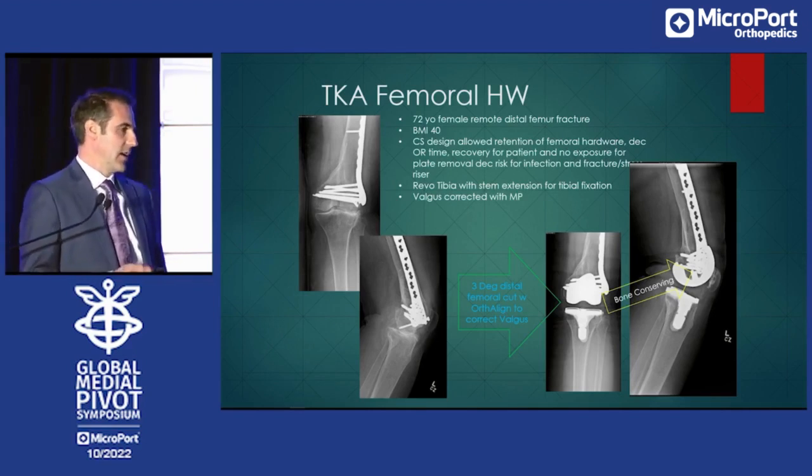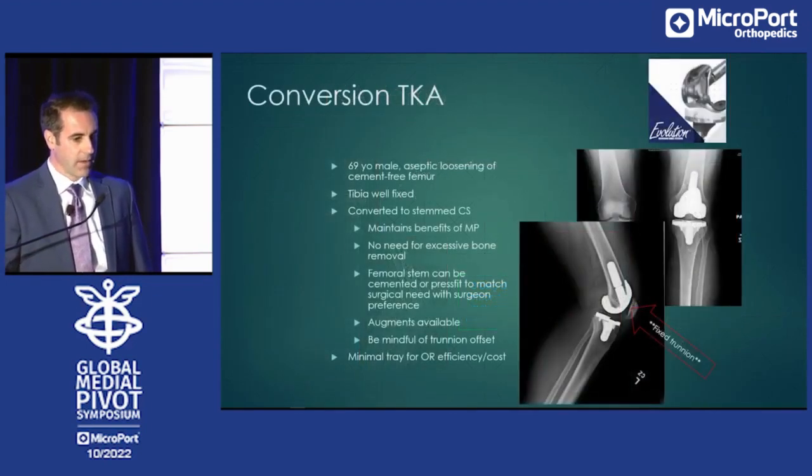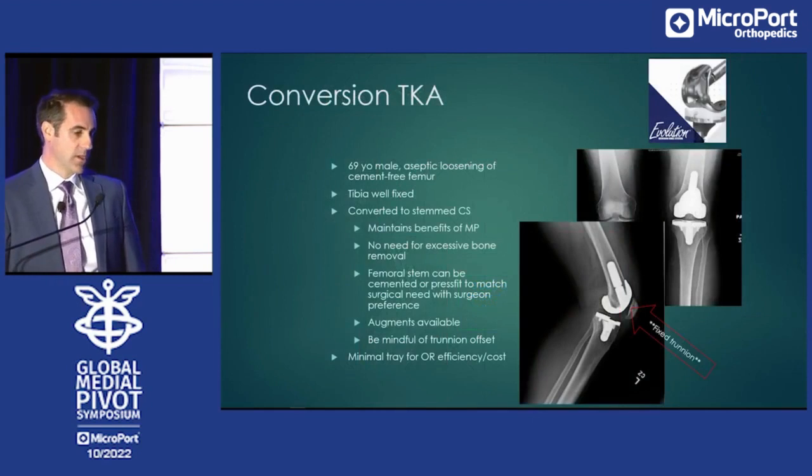And I used navigation techniques to get around for our distal femoral prep, so that we can actually leave all these components in place. I did do a 3-degree femoral cut, which I think is helpful sometimes in these valgus knees.